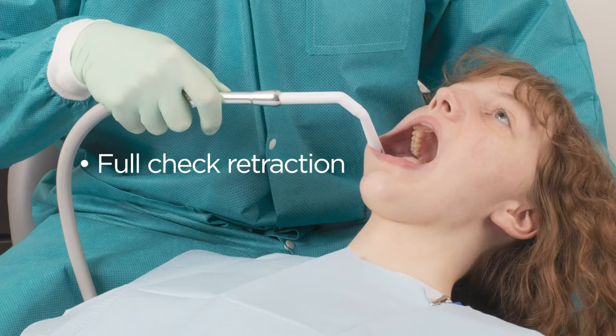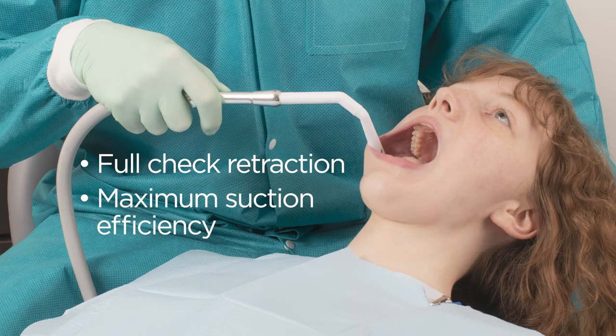Angolese's rigid construction provides full cheek retraction while allowing the hose to slope downward from the valve for maximum suction efficiency.